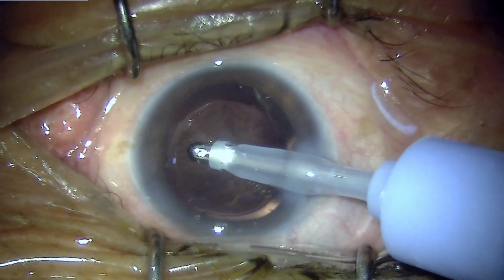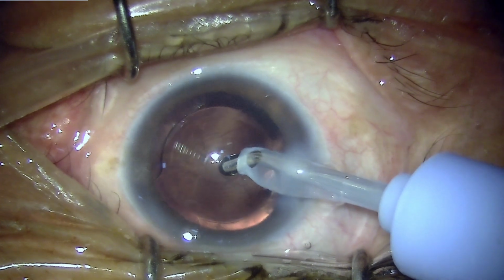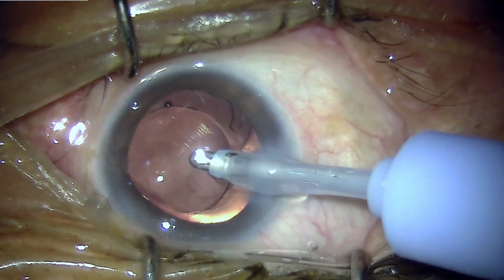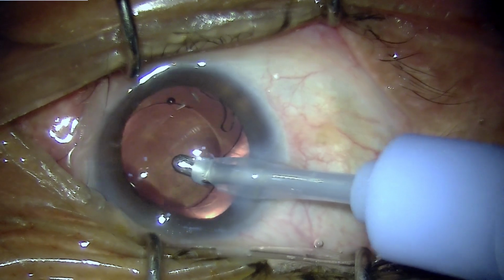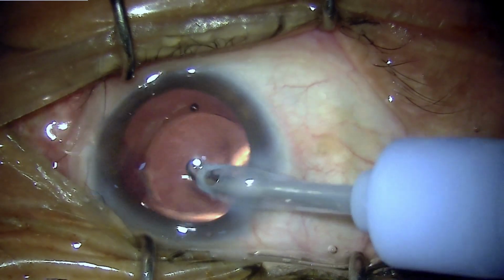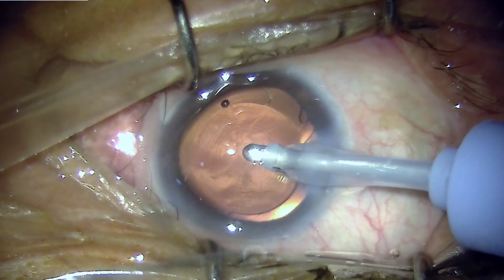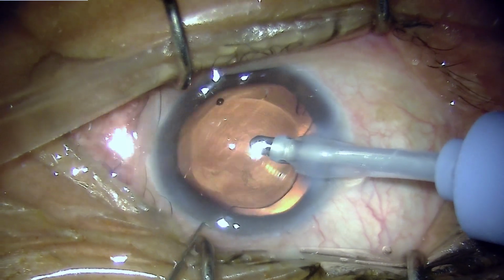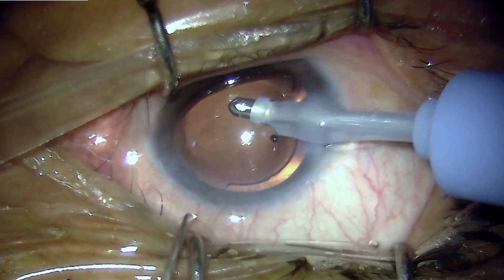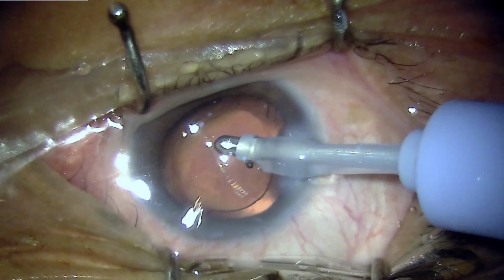So you start aspirating at a point where the viscoelastic is there and it is away from the PC rent area. So this will avoid engaging the vitreous. And then you very gradually, in a calculated manner, move closer to the area where you have the cortex. And we can see we have engaged the vitreous, which is causing the pushing of the IOL towards the nasal side. And this is a point where we have refluxed, and then again trying to deposit the IOL to the center. There is a strand of vitreous which is floating in the anterior chamber, and we'll just see if we can sweep it away so that it is away from our aspiration port.